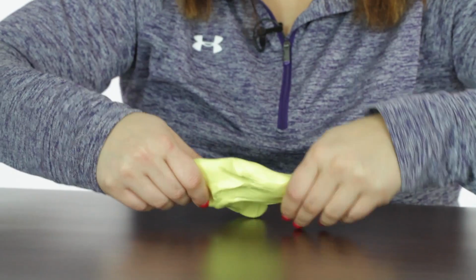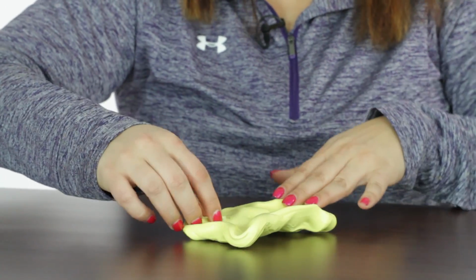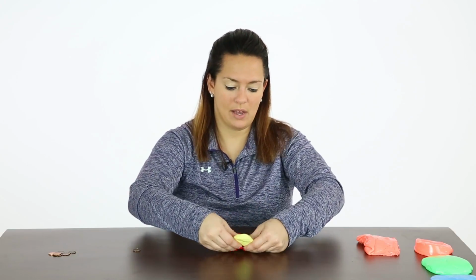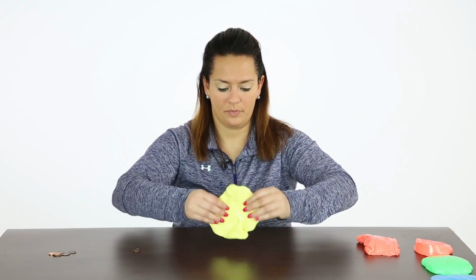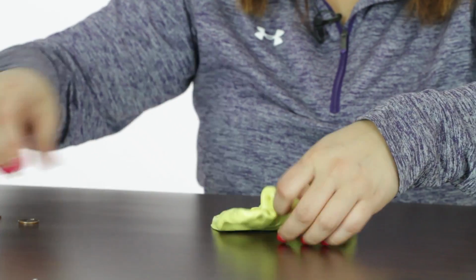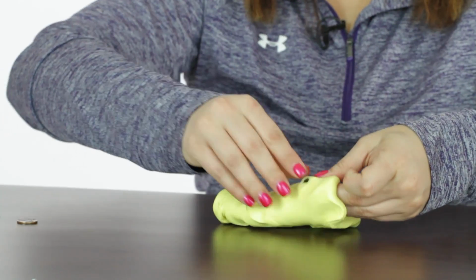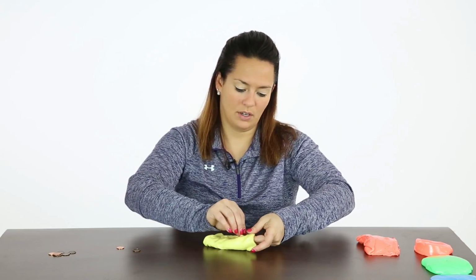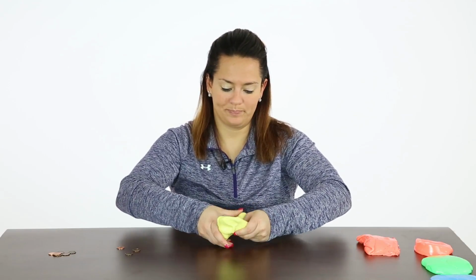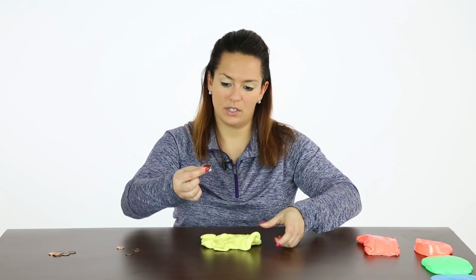So again, you can use two hands to pull. That's the best way to get strength in both hands. Dig it out. You can put them into a piggy bank or just make a pile. There's another penny. Again, using two hands to just kind of really manipulate, using your pincher fingers to dig. Try to find these coins or buttons if you have them. There's another penny.